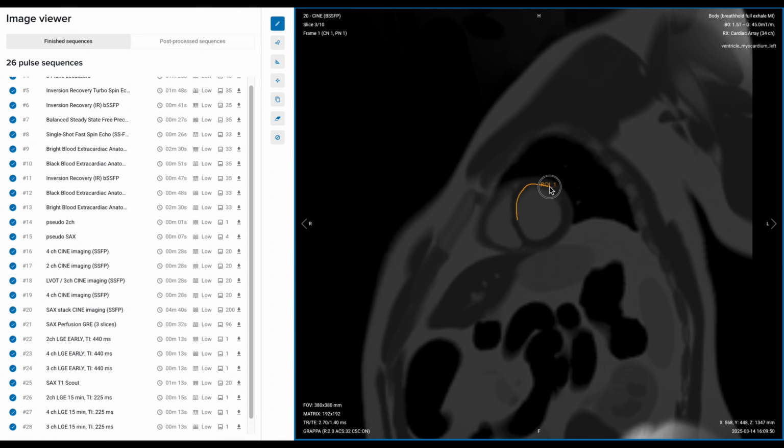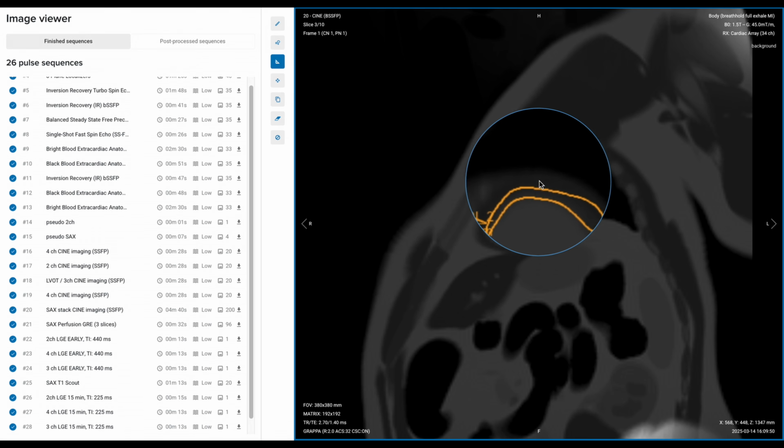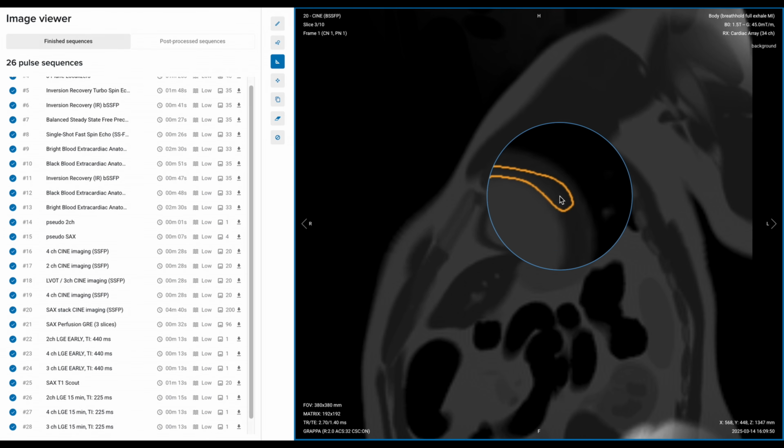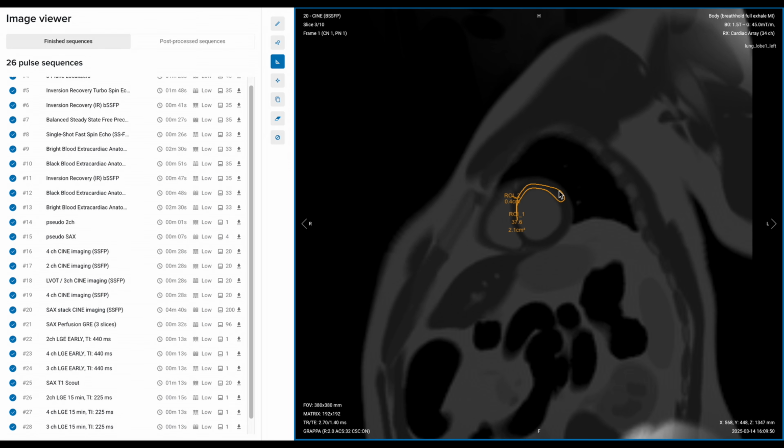We want to see if a myocardial infarction affects the tissue, like here, where the infarction is visible in this region. As you can see, some of the myocardium remains thick, especially toward the epicardium. This means the damage is limited to the subendocardial region. In that case, we describe it as subendocardial gadolinium enhancement or subendocardial infarction. There's still viable myocardium, and the subepicardial region may recover.